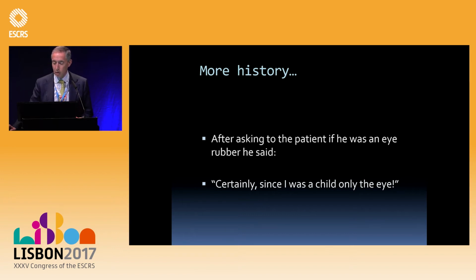So that shows you how very important it can be to have a clear cut, particularly where we are in doubt looking at topography. Could I do some refractive surgery in those cases or not? This is a good guideline and safe for increasing the safety of your treatment.